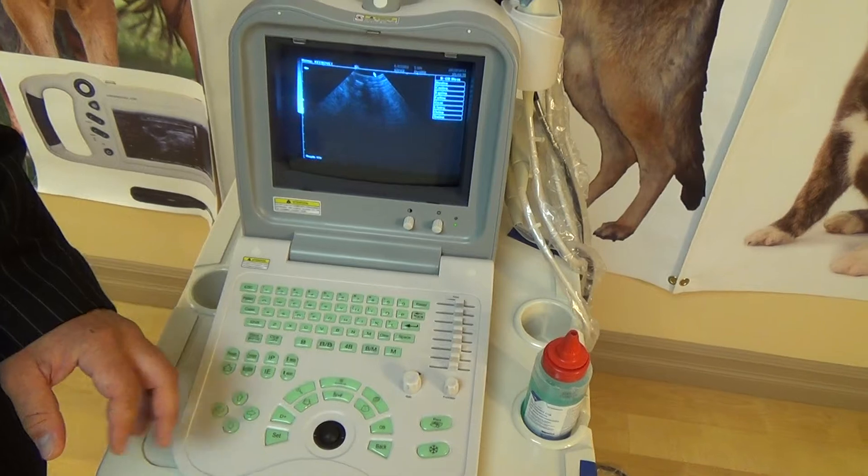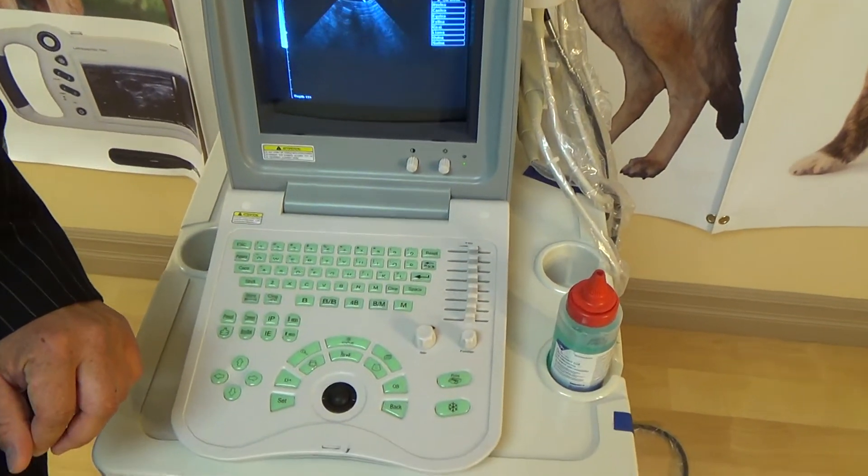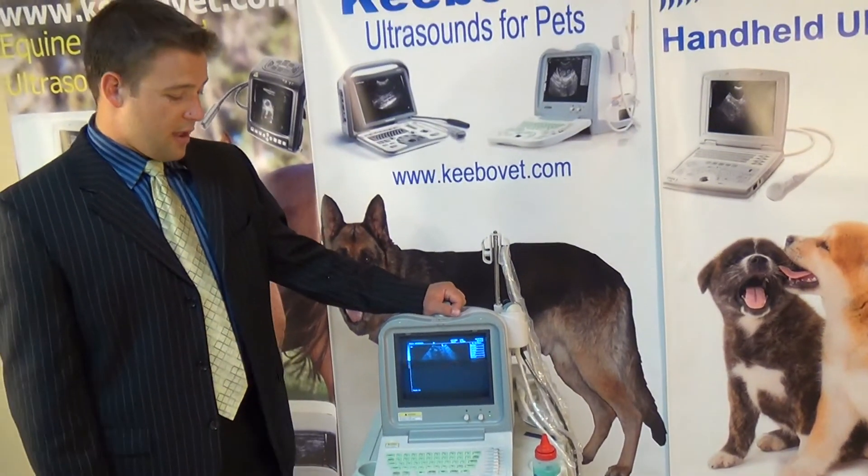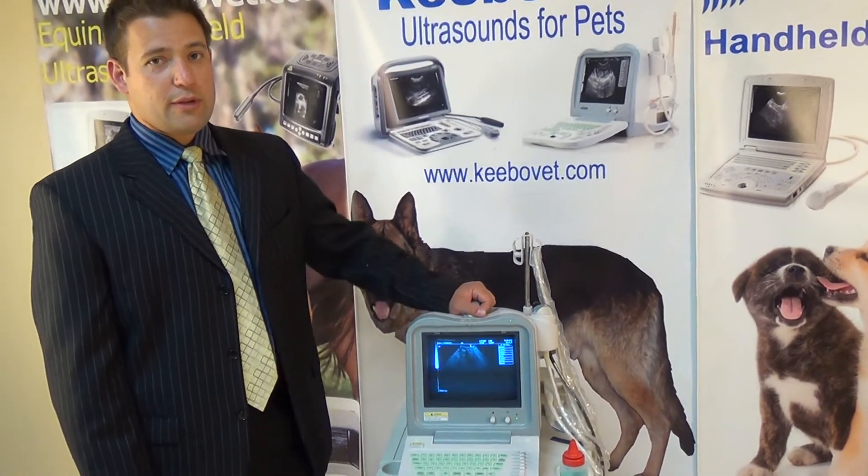That concludes part two of three of our machine. Once again, remember that the updating you see on the screen is just because it's a CRT monitor. We'll see you for part three of three shortly.